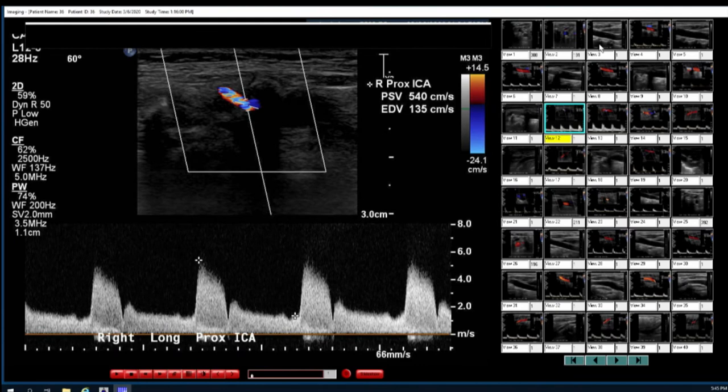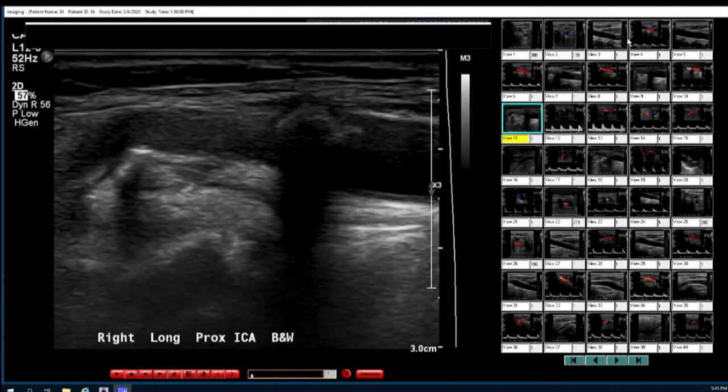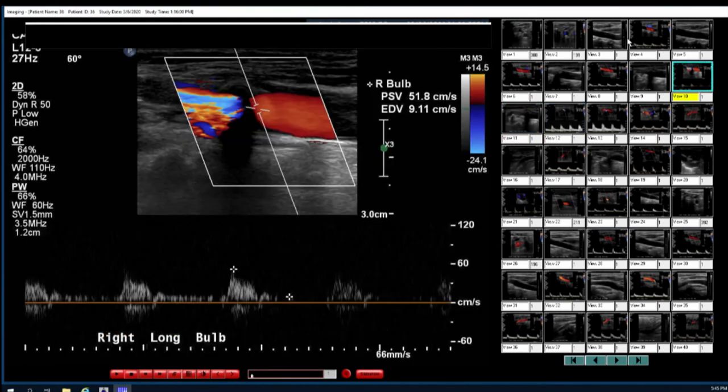Can you go back again? Sure. Because you made very interesting points there. On the right side of the screen, the red means nice laminar, calm flow coming in. And on the left side, it's totally disordered. Here's the storm. You can see the scale is actually a little bit low. I would prefer the color scale on the right-hand side to be 14 or 24. I don't see it too well.